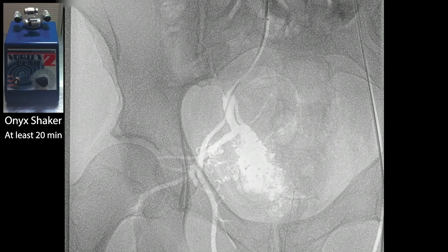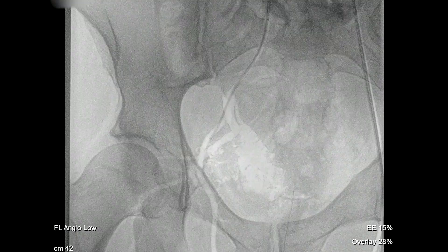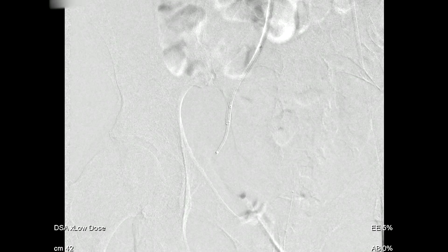Here you can see we're cannulating multiple branches of the right internal iliac. You start by choosing the most significant branches, doing multiple selective injections to get the lay of the land in terms of which are the predominant feeding vessels.